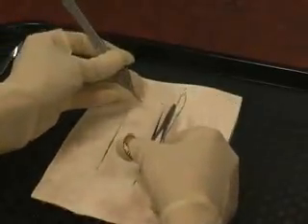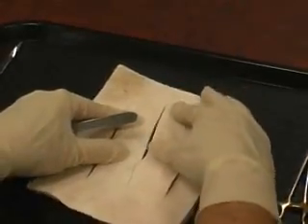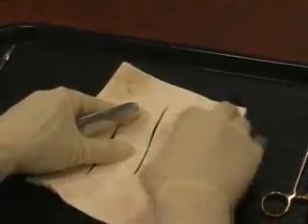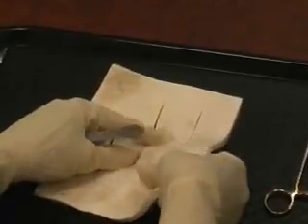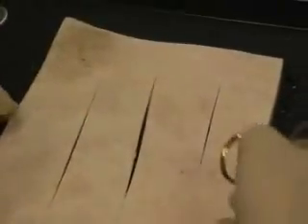If you were to start at one end and suture toward yourself, there is a possibility that if you keep taking too much on one side versus the other, you'll get something called a dog ear at the end, which basically will end up looking something like this. So you're suturing along, things are going great, and you find out that you have more tissue on one side than the other. If that does happen, what you should do is take everything out and start over. Occasionally, no matter what you do, the wound is just going to do that, and there is a way to correct it. But to avoid that in the first place, doing the rule of halves is probably a good idea.